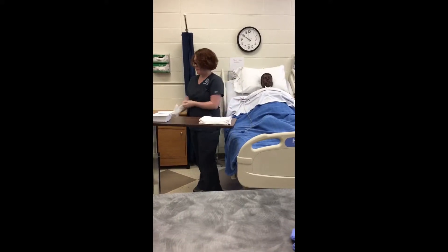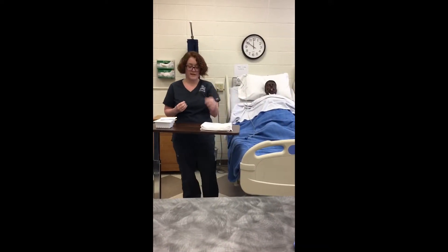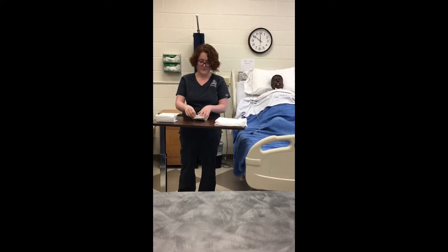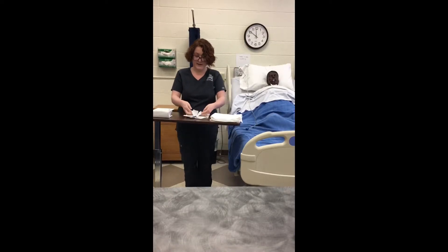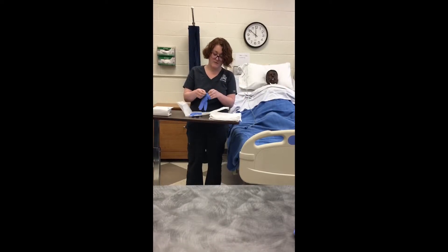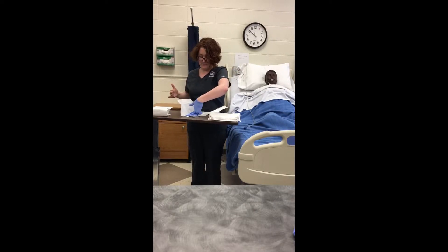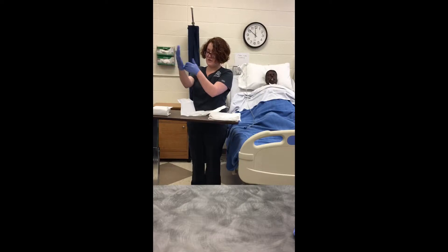Now that suction is good, I'm going to provide patient privacy — in this case they are in a private room and the door is closed. Now that I've performed hand hygiene again, I'm going to open my sterile kit away from me. I'll take out my sterile gloves, making sure not to touch the inside one-inch border. I'm going to don my non-dominant hand first, then being mindful of my thumb, put on my next glove.